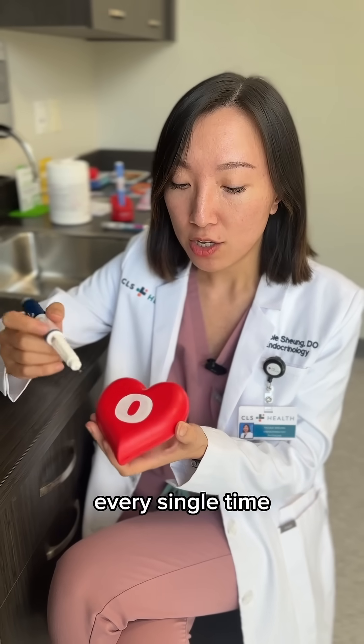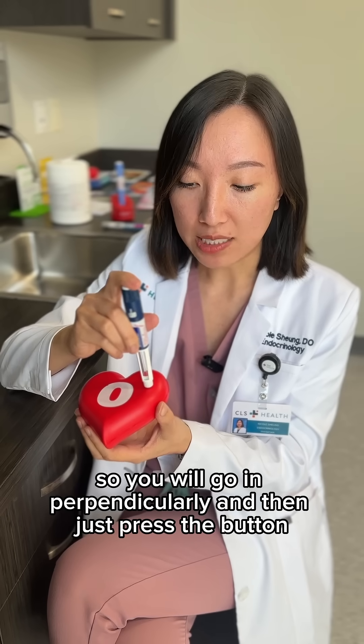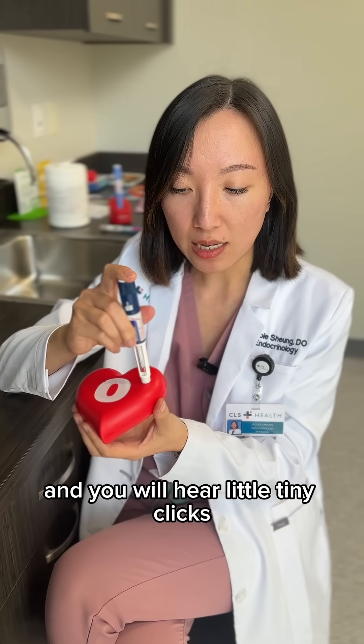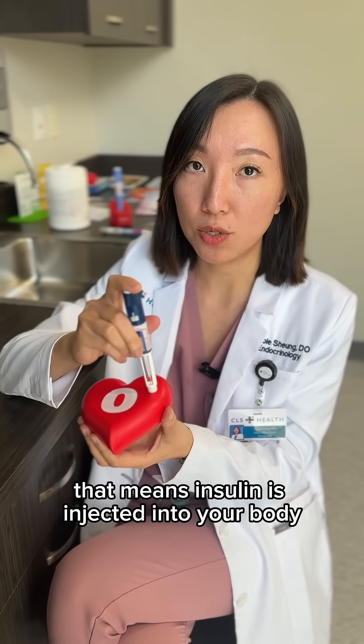Rotate the site to make sure that no scar tissue is formed every single time. You will go in perpendicularly, then just press the button. You will hear little tiny clicks, and until you don't hear any clicks anymore, that means the insulin is injected into your body.